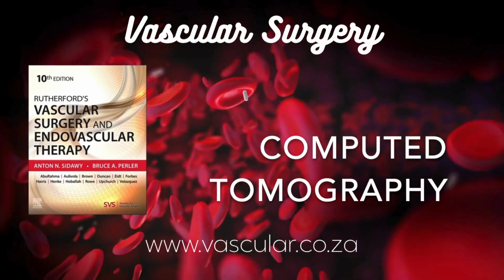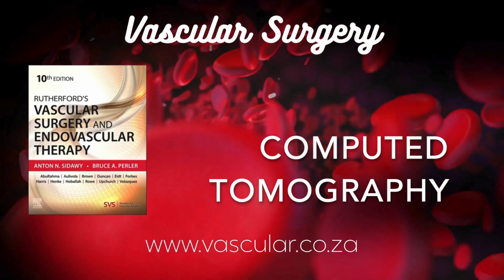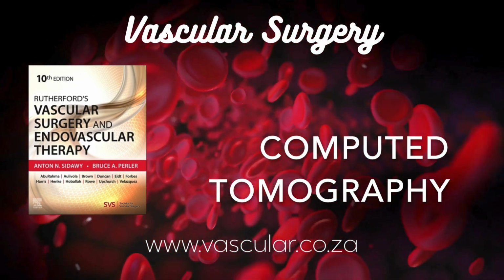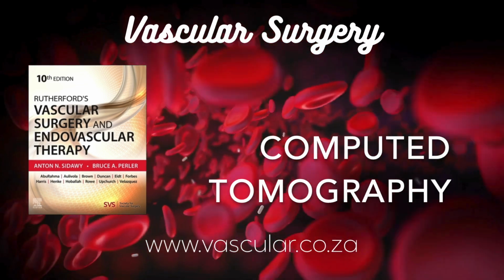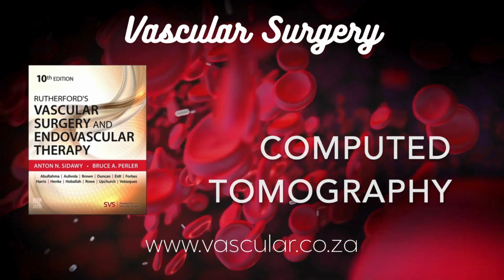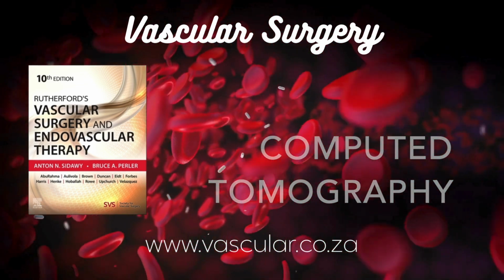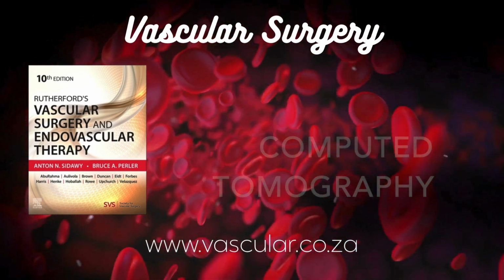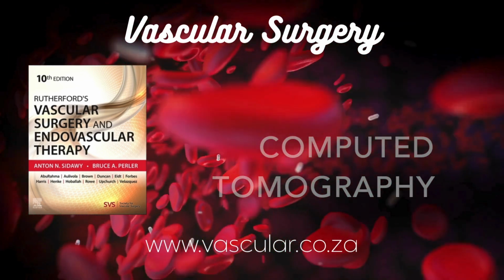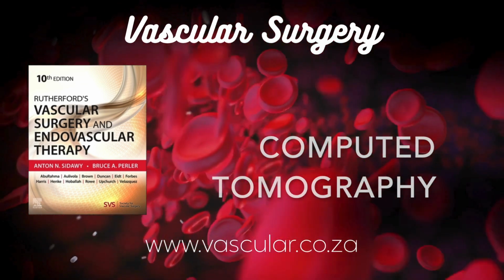Outside the heart and brain, where is CT really indispensable in vascular disease? Aortic disease is a huge one. Aneurysms, dissections, traumatic injuries. CTA is pretty much the number one tool. Why so dominant? Fantastic spatial resolution. The ability to do those 3D reconstructions for accurate measurements, absolutely critical for planning repairs, especially endovascular ones, EVAR-TEVAR. You can see tiny details like small branch arteries or subtle signs of endoleak after repair. And it's fast for emergencies.